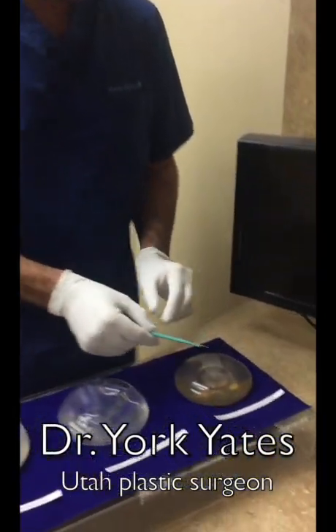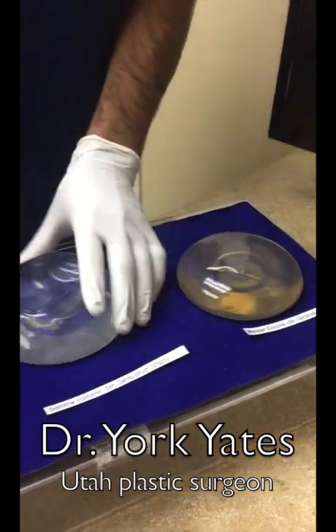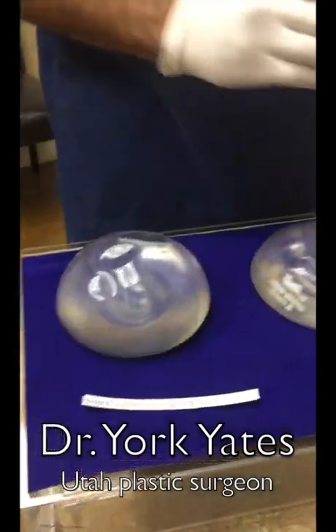We have a Mentor implant — all of these are totally intact implants and we're going to slice them for the first time. We also have a Sientra implant — these are standard silicone implants — and an Inspira implant. I'm going to slice it.